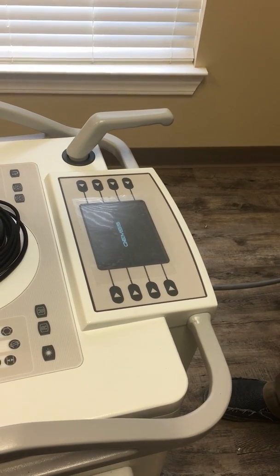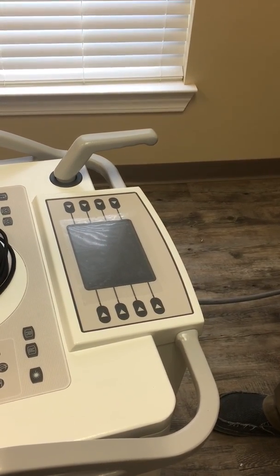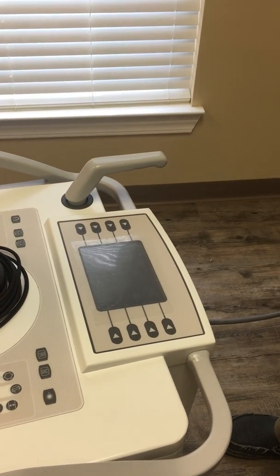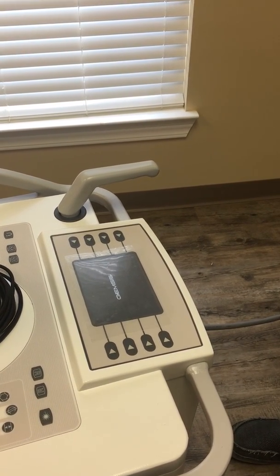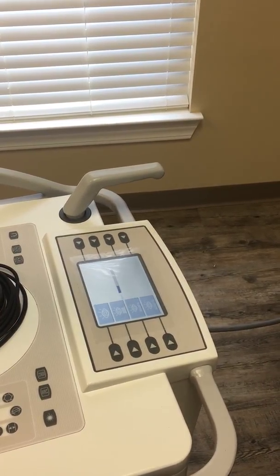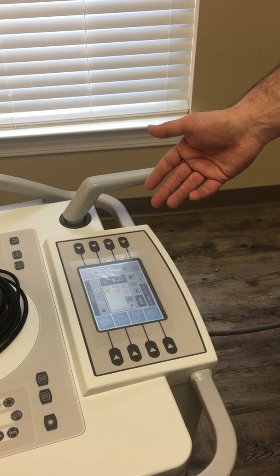So that button's not part of the proper shutdown process. I don't understand why it's there. So like I said, that service mode isn't going to do you any good. That power button there, not going to do you any good, really. If you bump it, just turn the system off, turn it back on. Every time the system boots up, it boots up into that normal fluoro mode.